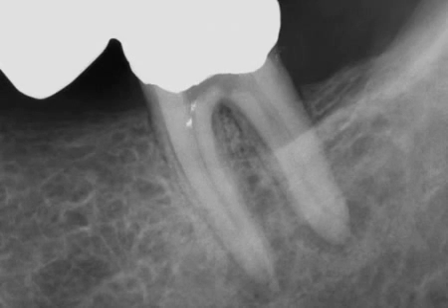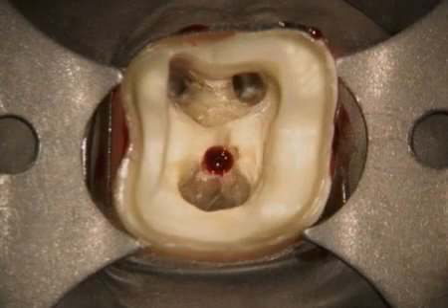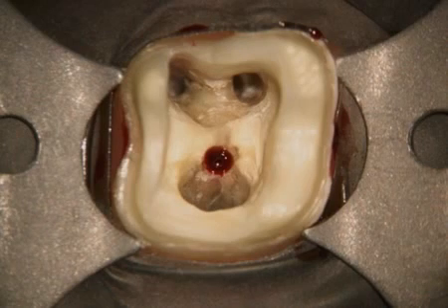Here is a case referred due to endodontic complications. Notice the previous access, possible perforation through the furcal floor, and the apical lesions. The bridge needed to be removed because it was defective. A photograph demonstrates complete access, the identified orifices, and a frank furcal floor perforation.